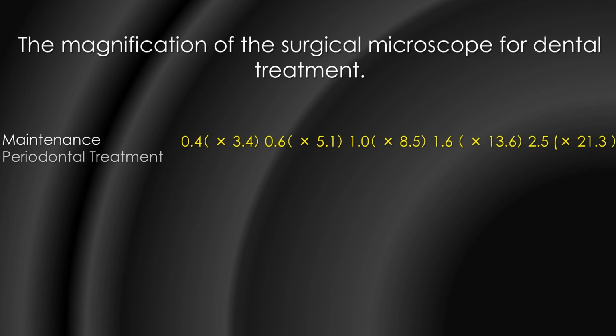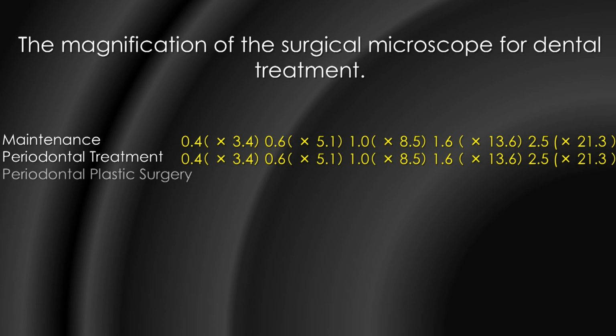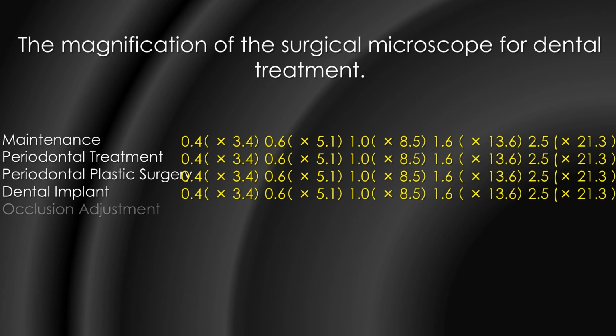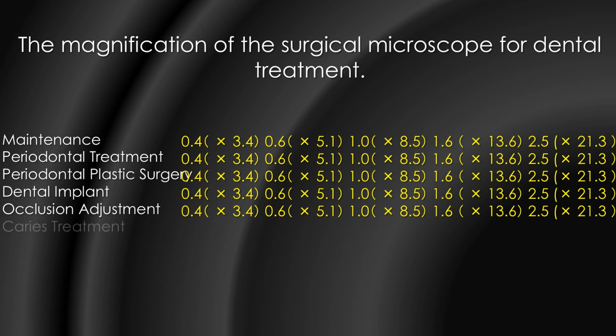So, the magnification of the surgical microscope for dental treatment. Every dental treatment needs a variety of magnification levels.